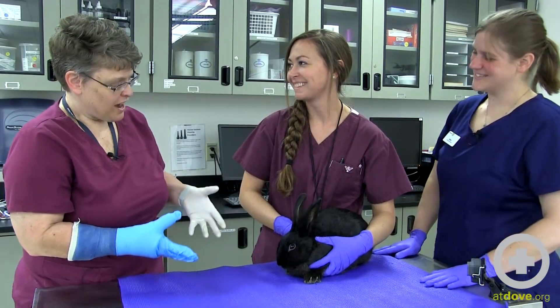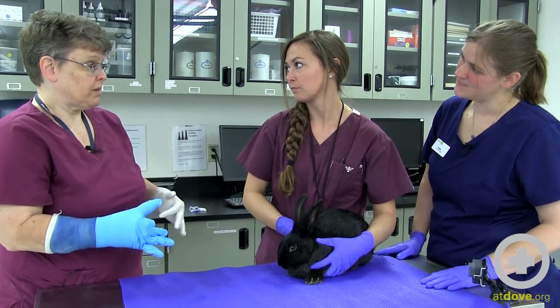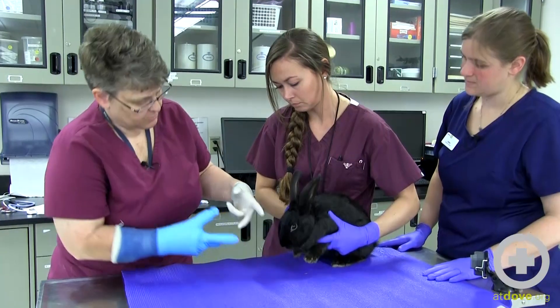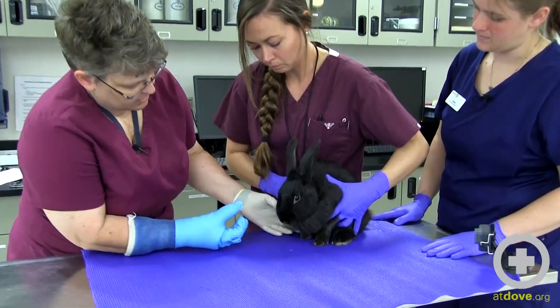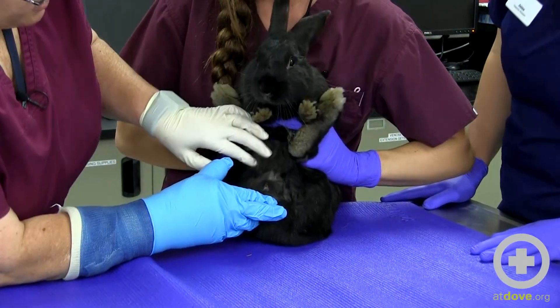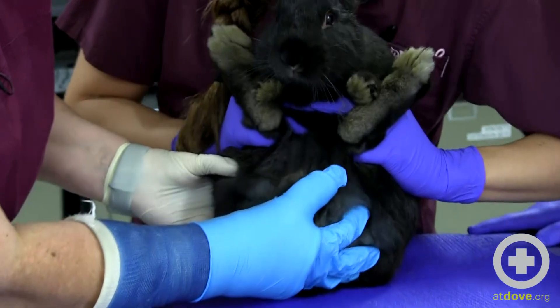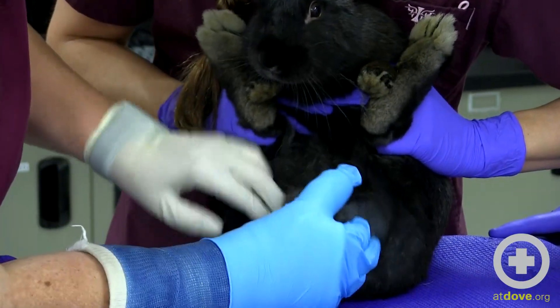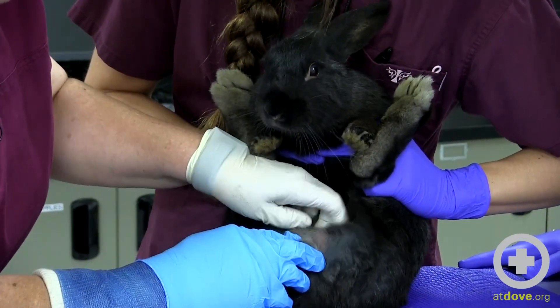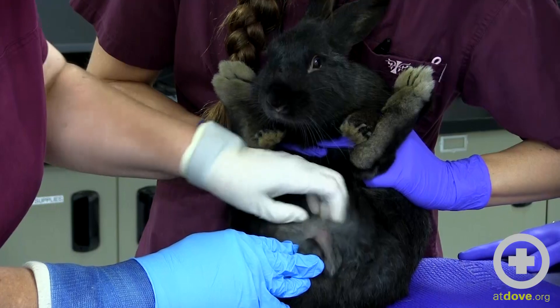I'm going to have Elisa restrain him in a perineal hold, which is used for a variety of things — one of which is sexing the rabbit. I do know that he's a male already. She's going to hold the forelimbs between her index and middle finger and the hind limbs between her ring finger and middle finger, keeping his body close and rolling him back. Right there, you can see he is still intact.